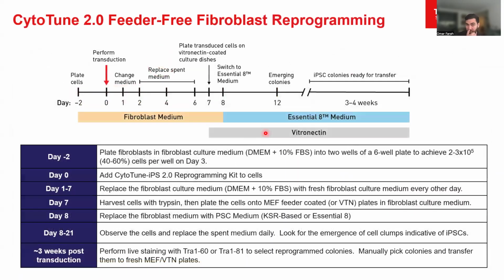So for the reprogramming, I promise that we're going to do a slightly deeper dive into the CytoTune Sendai reprogramming protocol. Here I'm showing you the schematic of the reprogramming protocol for fibroblasts, right? That takes anywhere between 3 to 4 weeks usually. And the way we start our reprogramming experiment here is we plate our fibroblasts in fibroblast media.